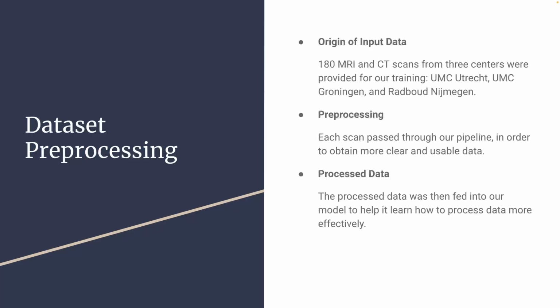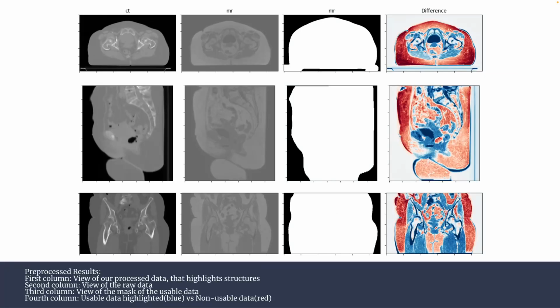And of course, we have to start with data gathering and pre-processing. Therefore, we opted for using an open source, anonymized dataset with both MRIs and CTs for each patient undergoing treatment for uterine cancer. All this collected raw data has further been pre-processed using a special pipeline which applies operations such as resampling and registration, resulting in an output format much easier to analyze. As you can see, when putting everything together and applying a special color encoding, data seems clearer, but still, reconstruction should give the possibility of extracting even more information for correctly identifying the anomalies in the tissues.